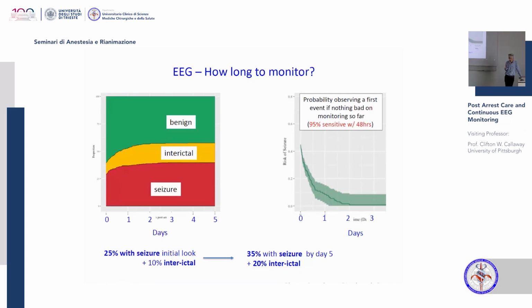From a practical standpoint, in my hospital, we have 10 machines for continuous EEG. We have neurosurgical patients, stroke patients, cardiac arrest patients. Everybody would like to monitor the brain all the time, but we have 10 machines. So there's a great incentive to decide I have monitored long enough and I should give the machine back to the pool so that other people can be monitored.